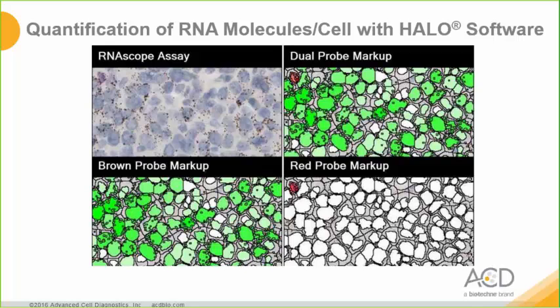This is an example from an RNAscope duplex red-brown chromogenic assay with hematoxylin counterstain. The markup images show the HALO ISH module markup for dual and single probe detection. In the top left-hand field, most of the cells contain brown dots, and there looks to be a single cell in the upper left-hand corner containing red dots. Unlike the example I showed you for SPOTSTUDIO, I believe the binning in this example is in line with our standard scoring system. So looking at the dual probe markup in the top right, these cells with white nuclei have no dots. The cells with light green nuclei have 1 to 3 dots.